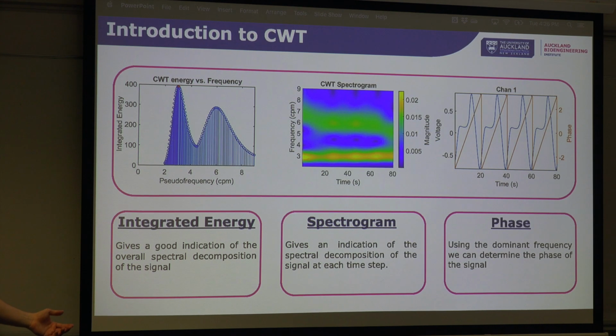Once we have the CWT, we can determine the dominant frequency at every time step and use that to determine the phase of the signal.